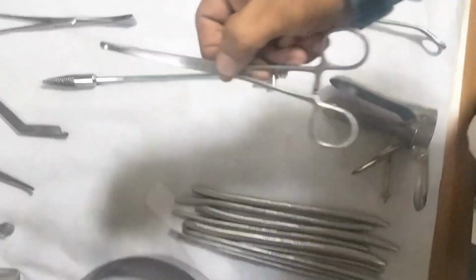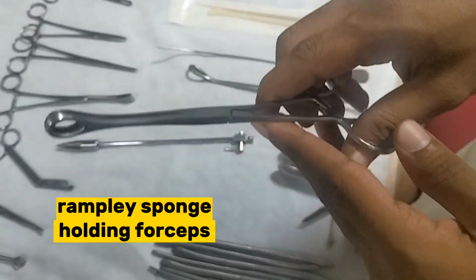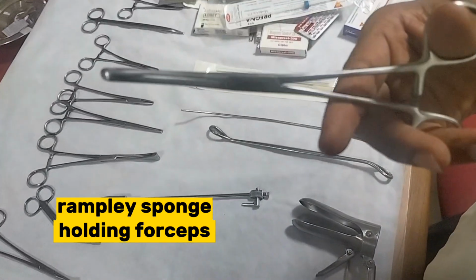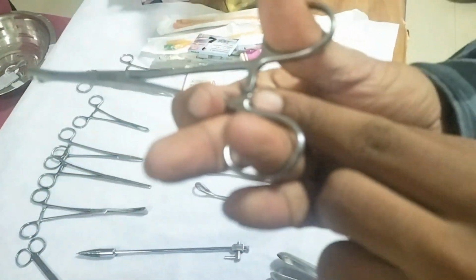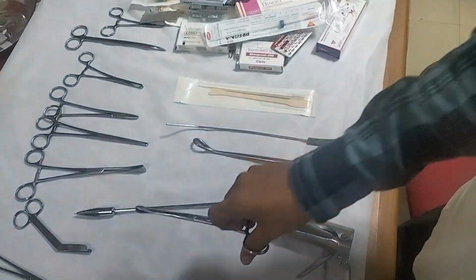Next. Here we got Rampley sponge holding forceps. It could be used for holding sponge and cleaning surgical sites pre-operative, and used for holding gallbladder in case of surgery if it is enlarged. Okay. Here we got in the proximal end ratchet locks, first lock, second lock, third lock, shaft, and oval fenestration.